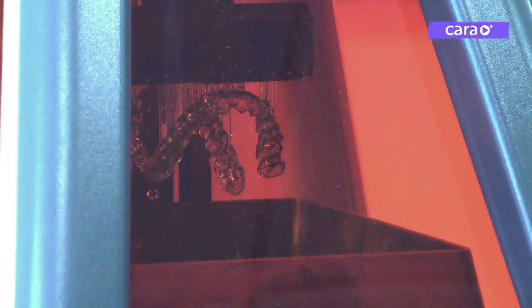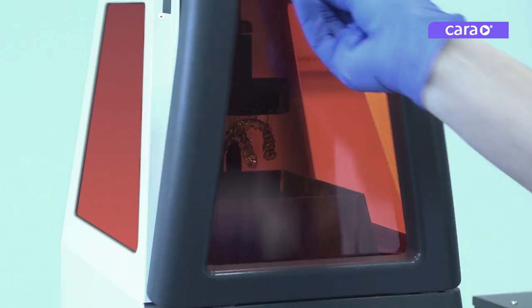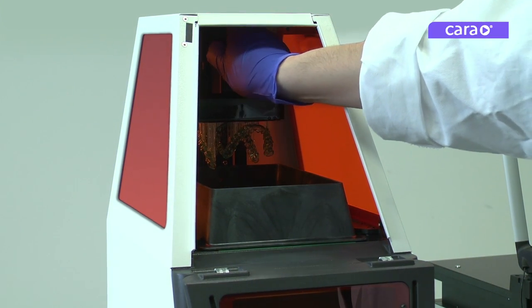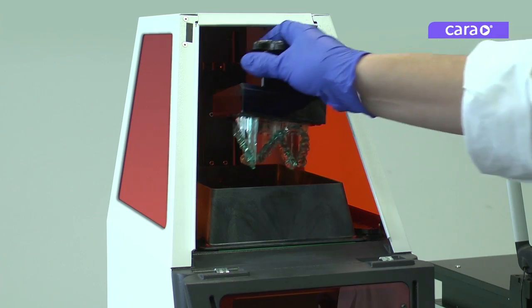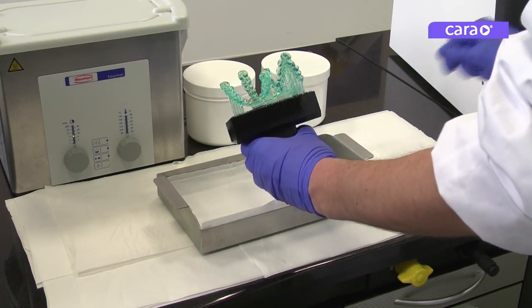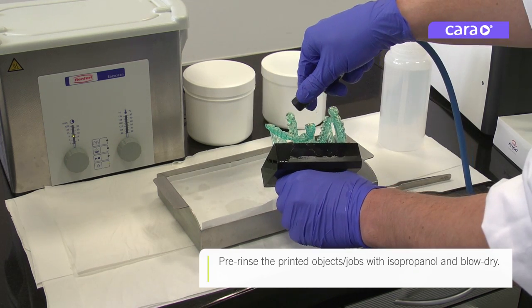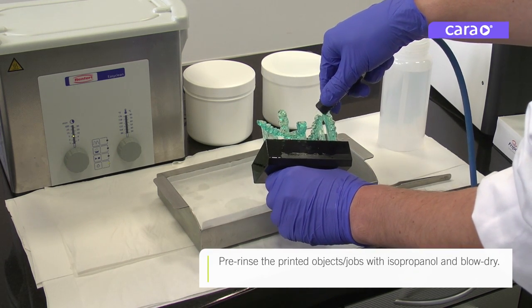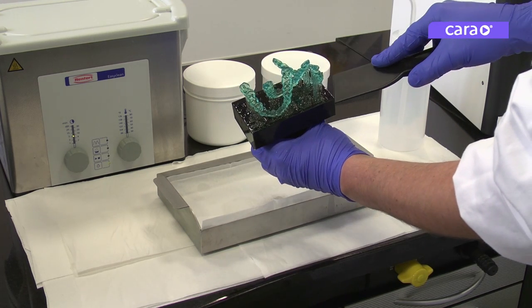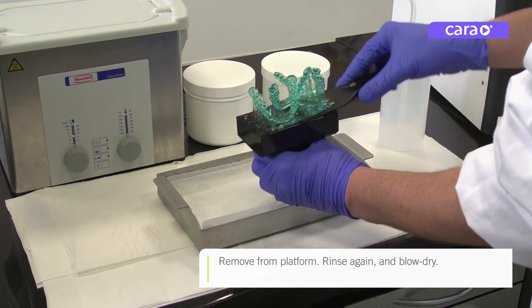You can now remove the build platform with the appliance or appliances attached. Pre-rinse the appliance or appliances with isopropanol and blow dry. Remove the entire assembly from the platform using the plastic scraper.